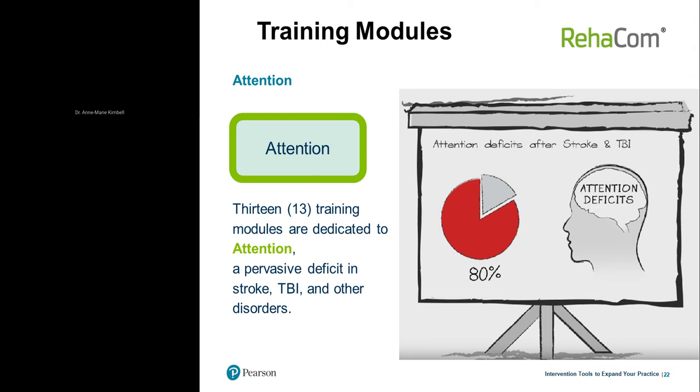And as you know, a good working attention level is foundation for all continued cognitive therapy. And attention is also a multidimensional cognitive function. And we know from decades of research that specific attention deficits require specific types of cognitive training. The training needs to follow a hierarchical organization. So the attention training modules include the 9 components of attention.